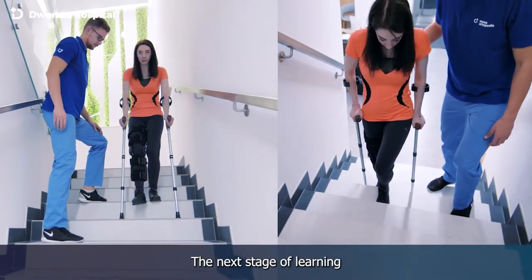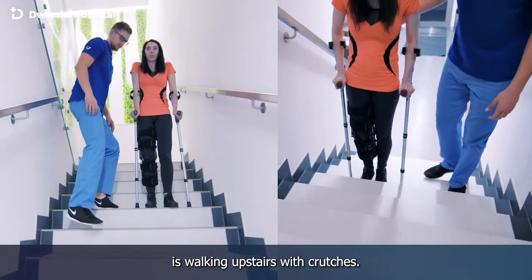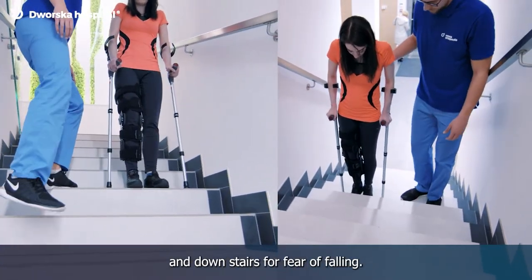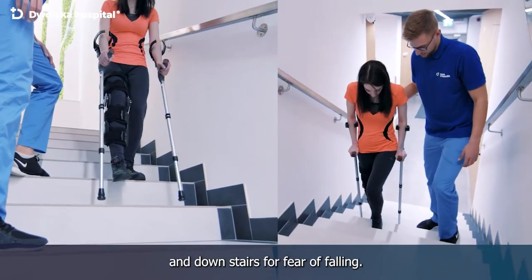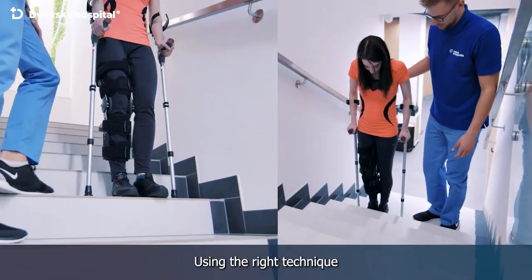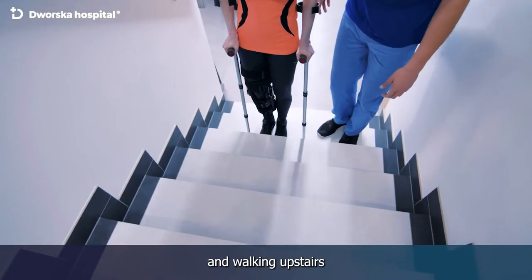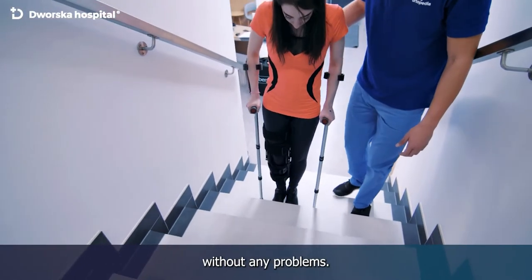The next stage of learning is walking upstairs with crutches. Many patients are afraid of going up and downstairs for fear of falling. Using the right technique in a simple and safe way, we are able to break the mental barrier and walk upstairs without any problems.